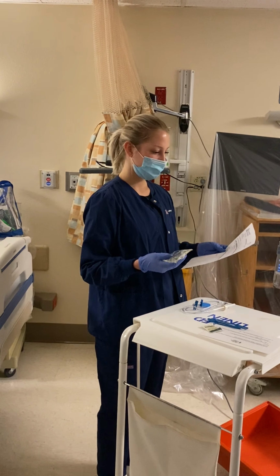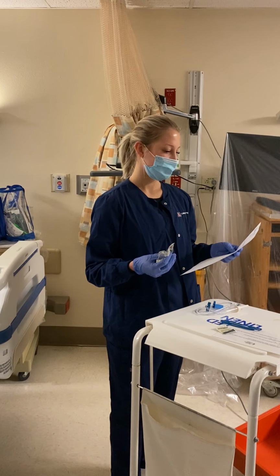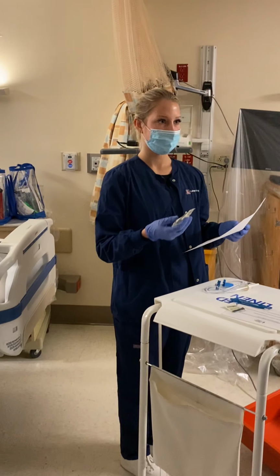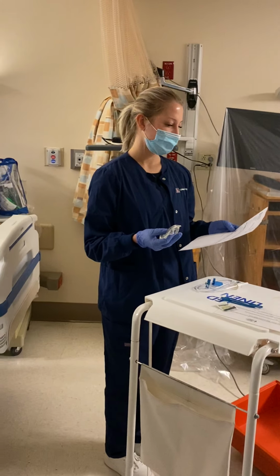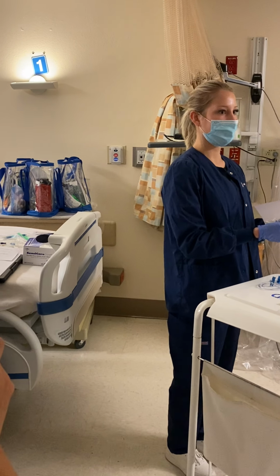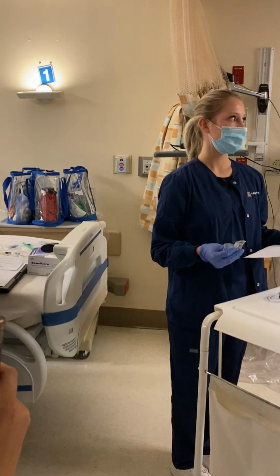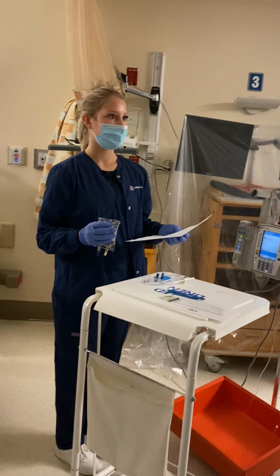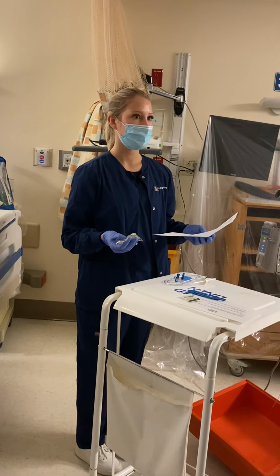Okay, what else? What did she miss? Right, just wait to see allergies. Allergies. And expiration. So again, expiration is not technically one of the 6 rights, but we do teach you to check expiration date. Do you check for allergies when you're checking their band? Yes. Okay. Again, if you realize you forgot and then you do it after you just did your checks, we give you credit for it, just as long as you do it before you hang it. Okay, it's important that you do it before you hang it.